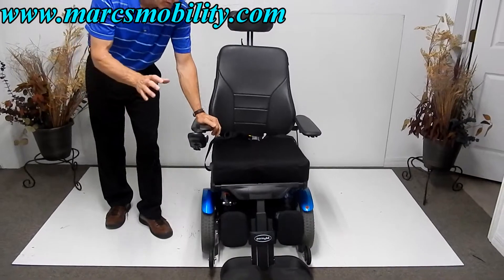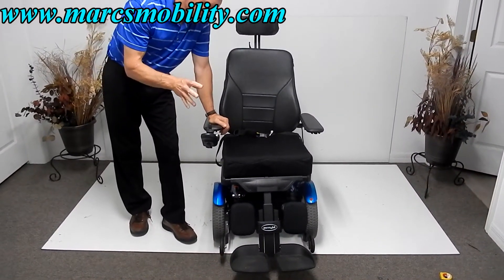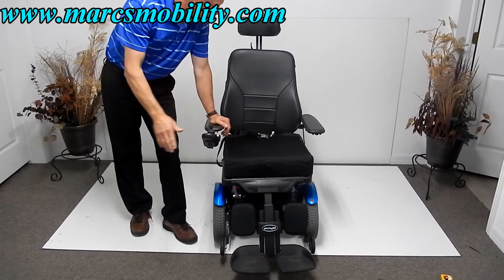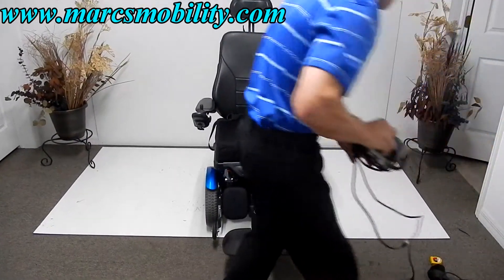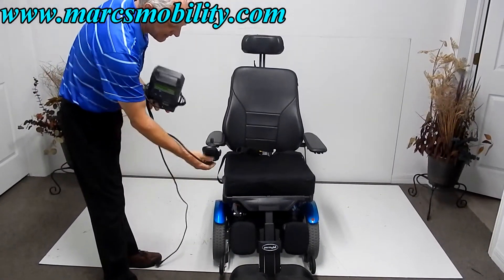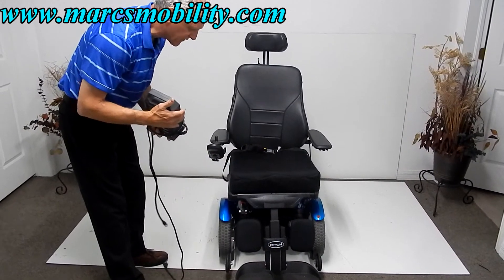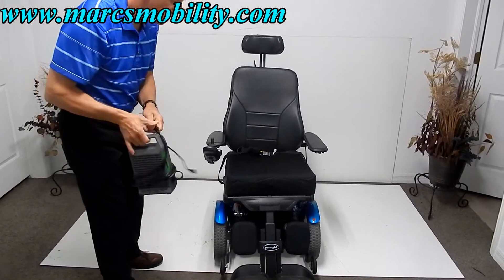If you need a power chair that's fully loaded — 8-inch seat lift, electric tilt, electric recline, electric legs, all the comfort you need with only 12 miles — this is a nice power chair. To charge it, take your Permobil charger and plug it into the bottom of your joystick. Once the light turns green, you're fully charged, and the charger will stop automatically so you don't have to worry about overcharging.